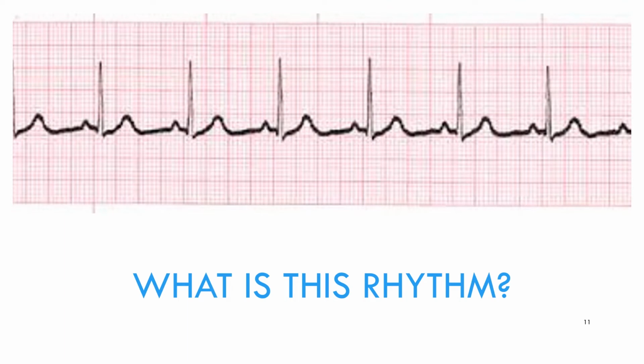So they do an EKG on the patient, and this is the strip they develop. I have a couple of questions for you. Number one, what is the heart rate of this patient? Remember before, you have the QRS, you have the QRS, you have the QRS, and in between the QRS you have these big blocks, number 1, number 2, number 3, and number 4.